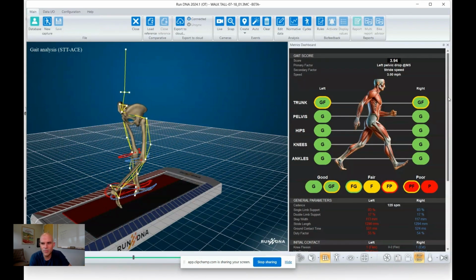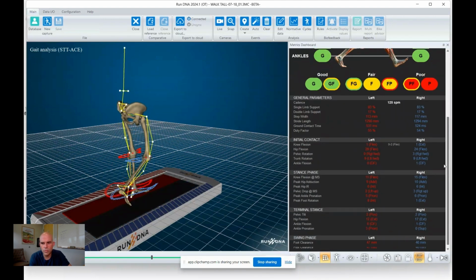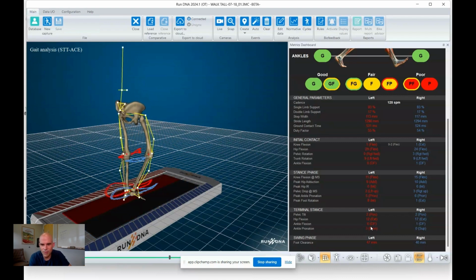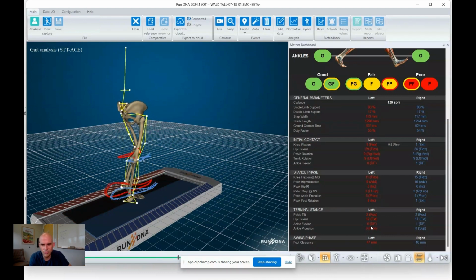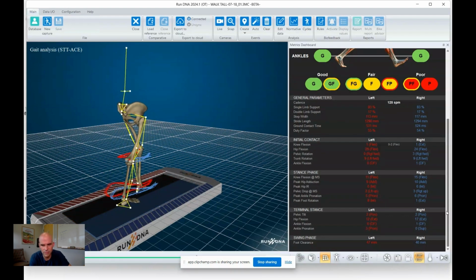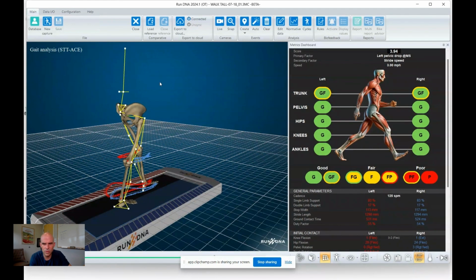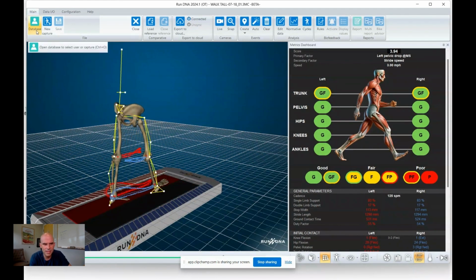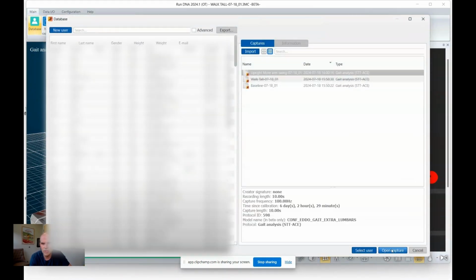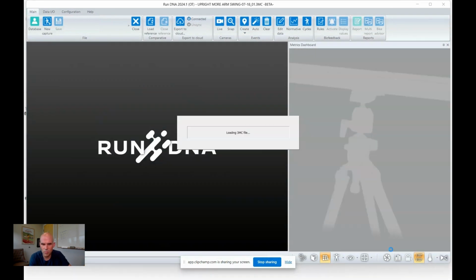So what that did is really help us refine our cue and say, good job, but you're really stiff when you're doing that. So we saw that ankle dorsiflexion at terminal stance went from 11 to 6, so it's improved, still a 5 degree difference side to side. But we said, let's refine the cue a little bit more because that score went up. And it's not always bad that it went up a little bit, but we said, why don't you keep tall, but relax your arms a little bit, let your arms swing a little bit more.